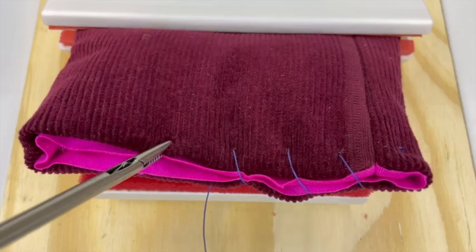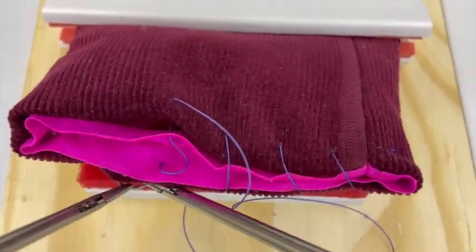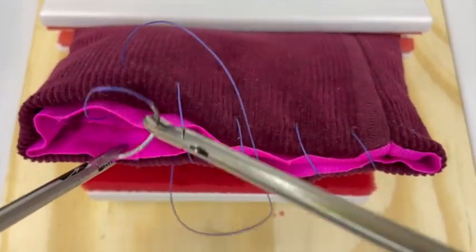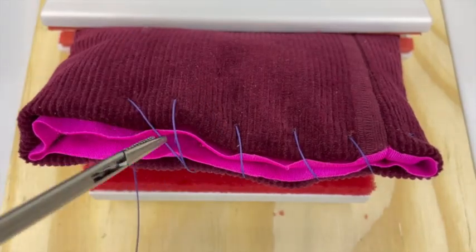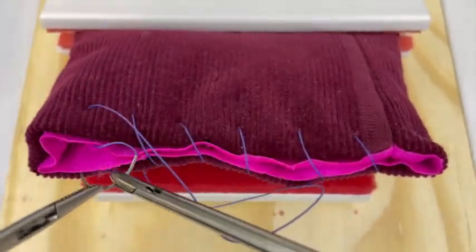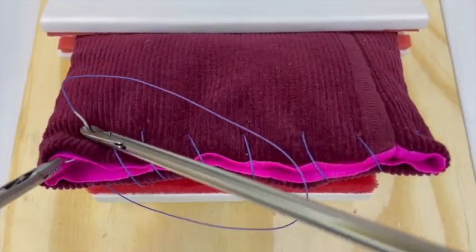When suturing on a live patient, it is important to always keep the needle within the field of view in order to avoid inadvertent injury to surrounding structures. If the needle leaves the field of view, its location must always be known. We recommend hubbing the needle at the needle driver trocar so its off-screen location is never in question.